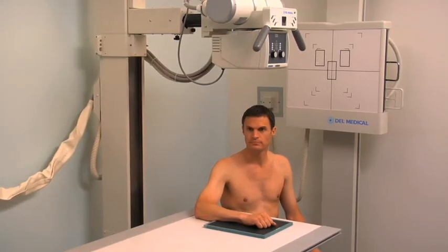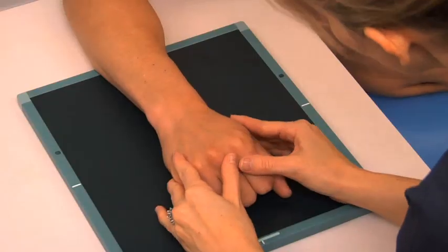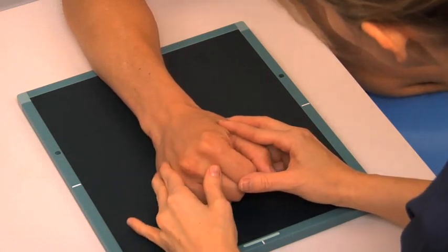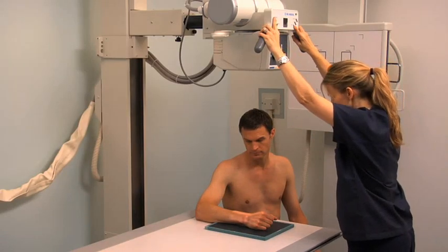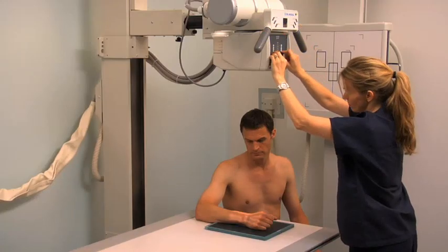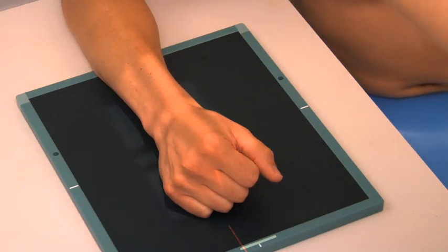With a new cassette in place, obtain a PA oblique projection by rotating the patient's wrist and hand laterally with the medial aspect in contact with the cassette. Ask the patient to place their hand in a fist position and angle the wrist 45 degrees medially with the ulna side touching the cassette. Align the central ray and center it on the mid-carpal area. Collimate the light field the same as for the PA wrist and expose the cassette.